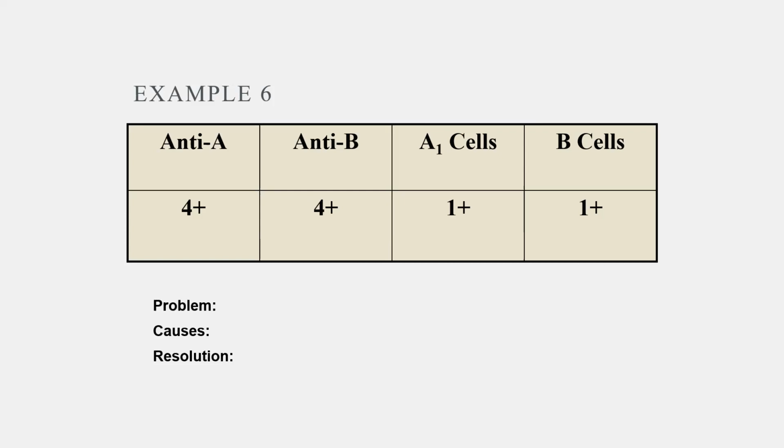Because they should have A and B donors on their shelves at all times, and they should have anti-M antisera that they can type those donors for, prove they're negative, and then use them. But if they don't have an SOP for that procedure, then yeah, they would send it out. Most hospital labs will send out ABO discrepancies. Unless you're like Shan. Shan pretty much does everything on their own. Except platelet stuff.